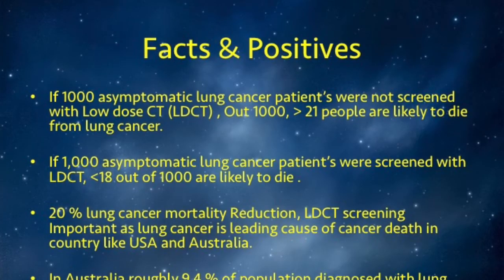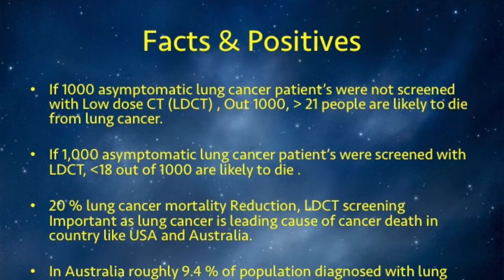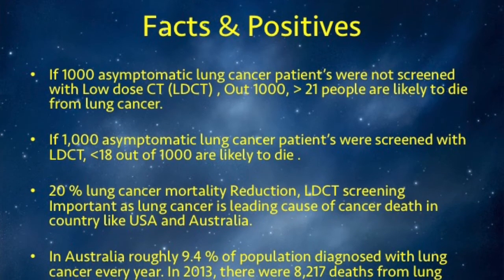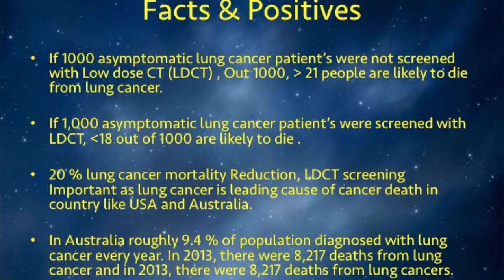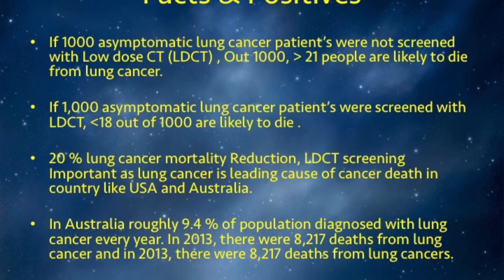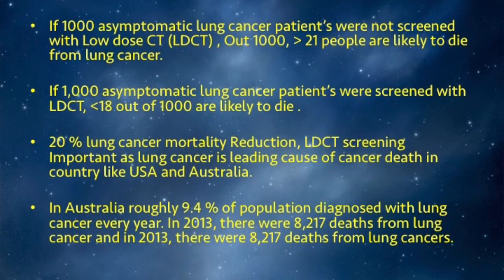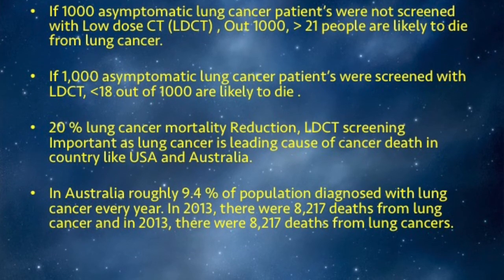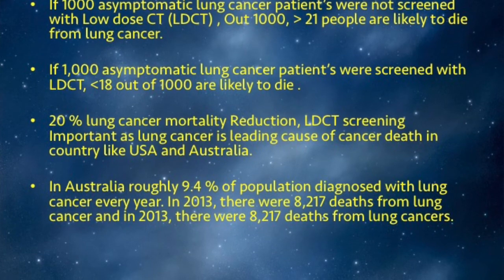The main positive of CT scan evolved around the fact that it has high capacity to diagnose the cancer patient at an earlier stage with relevant sign, genetic history or risk factor. The targeted CT screening, such as lung cancer screening using the low-dose CT, has shown some effectiveness in the detection of asymptomatic lung cancer. It is used in people with high lung cancer risk, such as long-time smoker, miners and other industrial workers who have been exposed to highly radioactive materials such as coal and uranium, and people with the lung cancer family history.